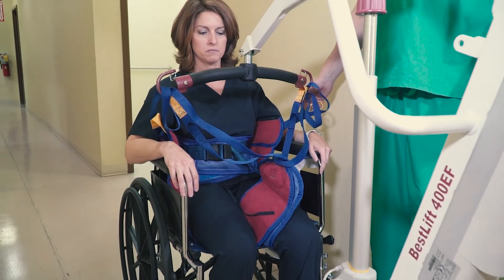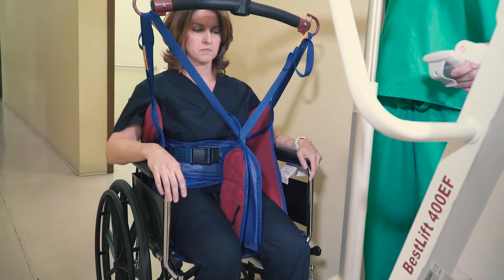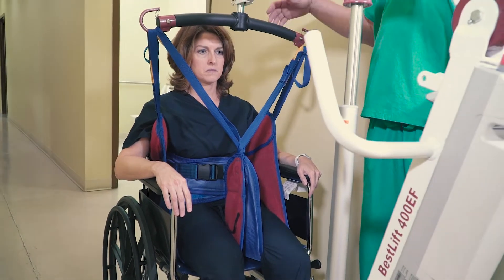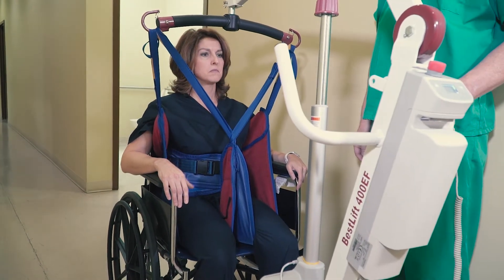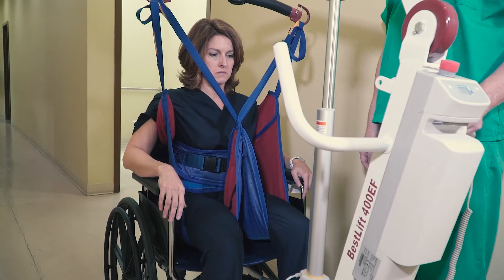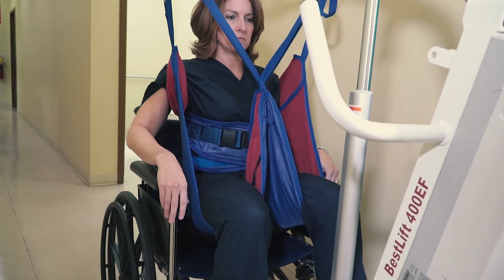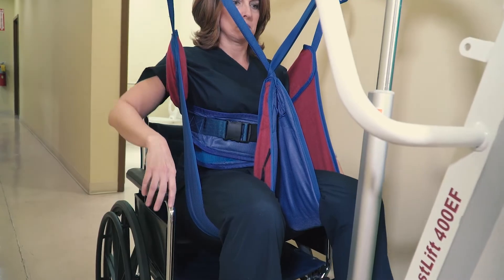Before lifting, make sure that the patient is fully inside the sling and that the straps and loops are not caught on the wheelchair. With one hand on the patient and one hand on the lift controls, slowly begin lifting the patient. As the patient's wheelchair is locked in place while the lift is not, the lift will move toward the patient rather than jerking them out of the chair.